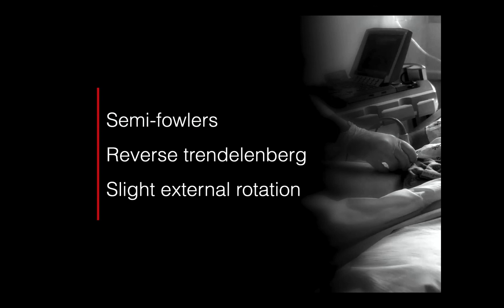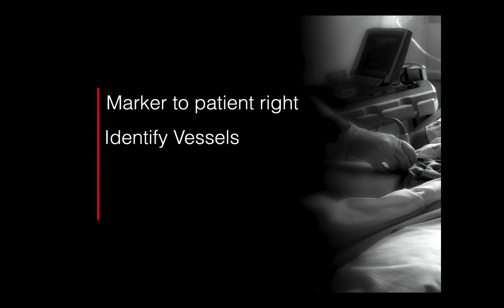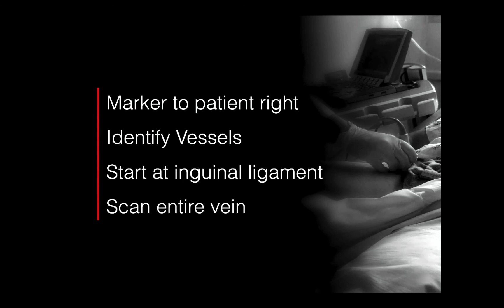Position the patient in the semi-Fowler's position or reverse Trendelenburg — get the head up above the level of the legs to allow gravity to pull blood down into the vessels and distend them. Externally rotate the patient's legs to open up the inguinal canal area. With the probe marker towards the patient's right, identify the vessels and scan from the inguinal ligament all the way down through the popliteal fossa, performing compression every several centimeters to confirm venous patency.